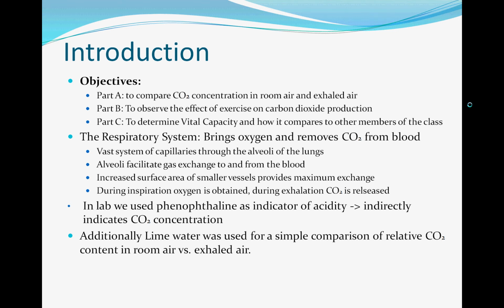The objectives of the lab are quite simple. In Part A, the objective was to compare the CO2 concentration in room air with that of exhaled air. In Part B, the objective was to observe the effect of exercise on carbon dioxide production. And in Part C, the objective was to determine the vital capacity of the two subjects and how it compares to the other members of the class.